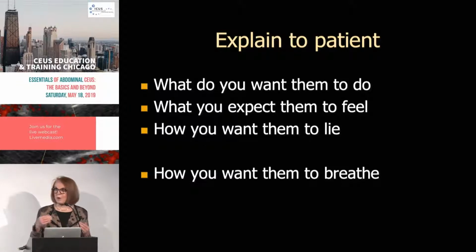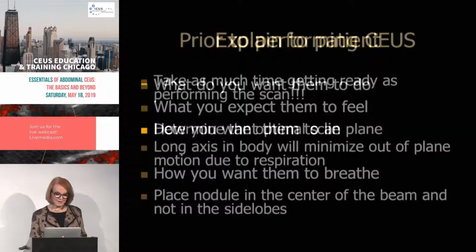Because then when our interventional radiologists go to do the scans, we're famous for this. They say, well, Stephanie can see it, but nobody else ever could. And so, of course, it's not true. If we tell them how we saw it, they can reproduce what we're doing. And then in addition to that, they invite us to come, so we're actually always there anyways.